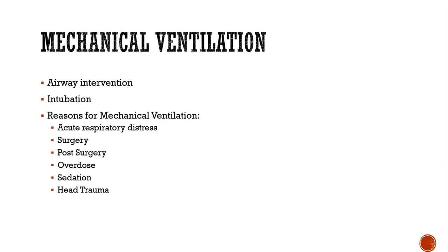All right, so mechanical ventilation. So airway intervention, intubation, and the reasons for the use of it could be from acute respiratory distress, surgery, post-surgery, overdoses, the patient needs sedated, or maybe we've got some kind of head trauma. Those are just a few reasons.